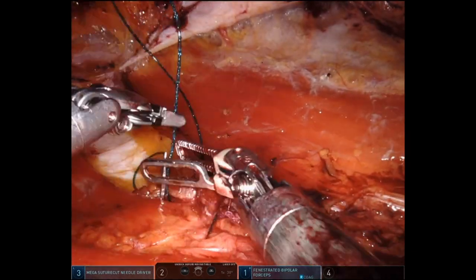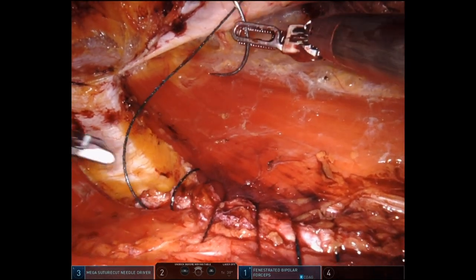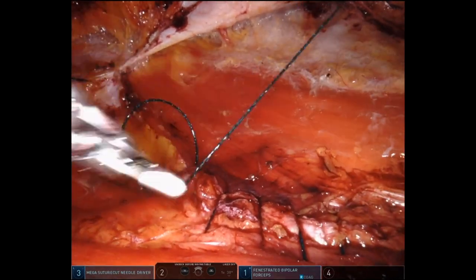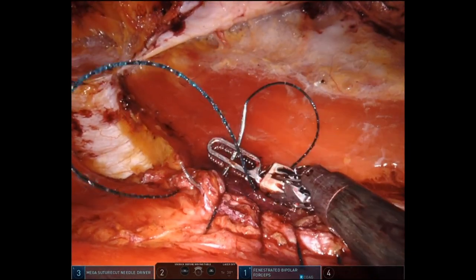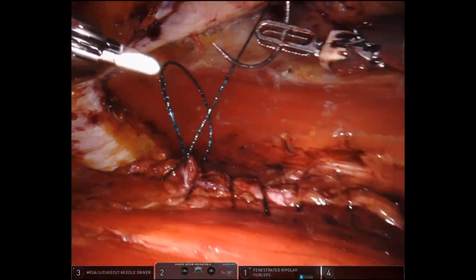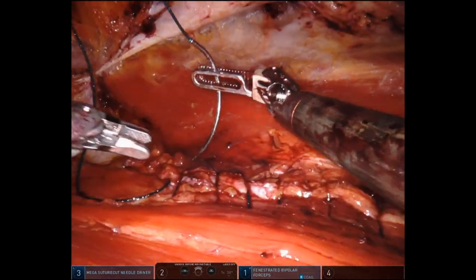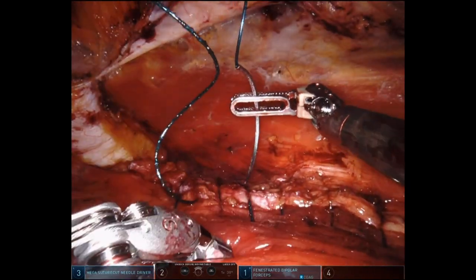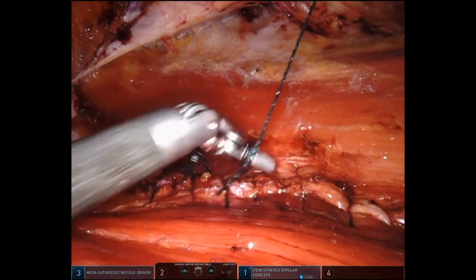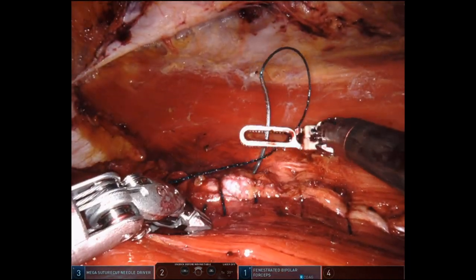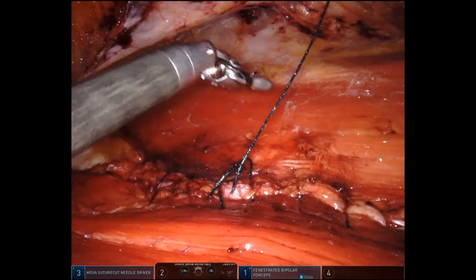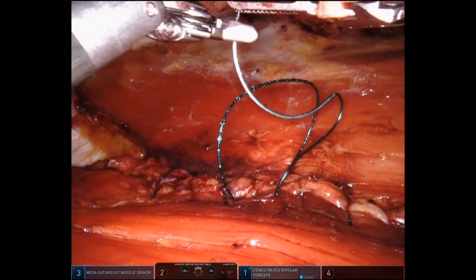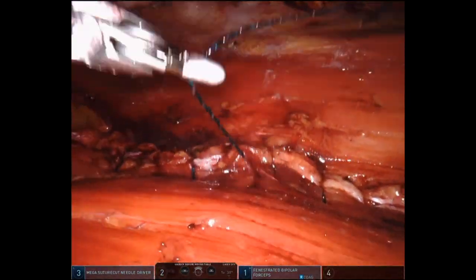As you can see, this just makes it a lot easier to suture. Now I'm going to run the suture back a few times just to bring the post-rectus sheath edges together, then trim the suture and turn the image back to right side up. It's a very quick maneuver, so if I feel like it's really going to help me speed up when my right hand gets stuck, this is when I use this technique.